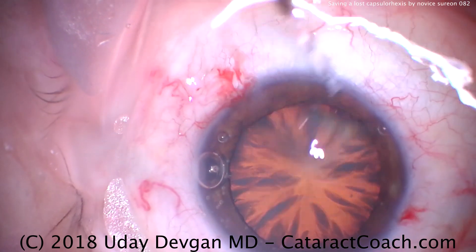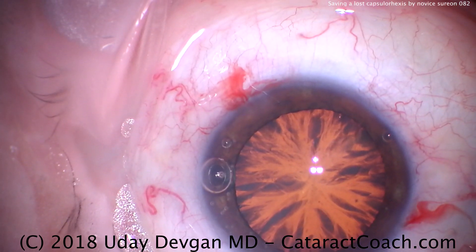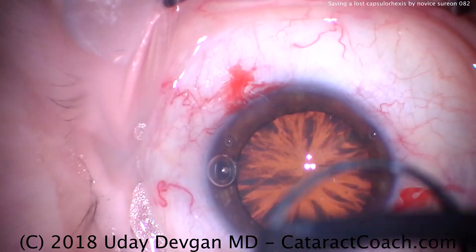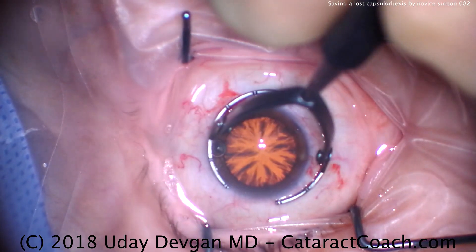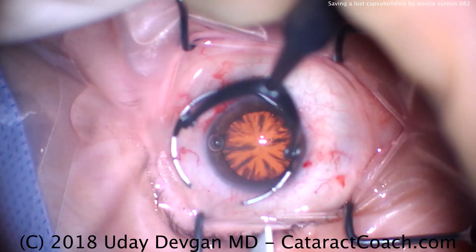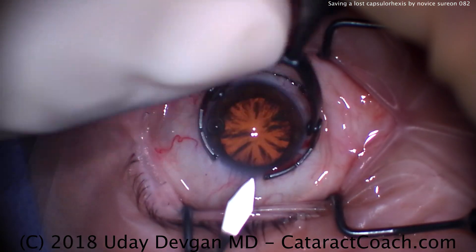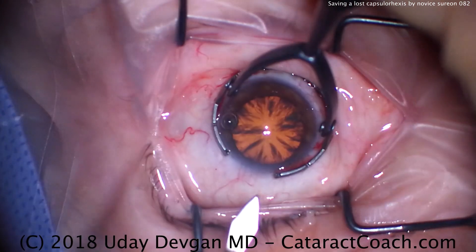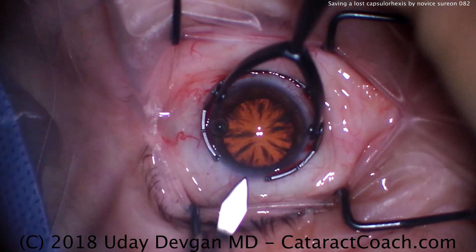Now it's going to be time to make the main incision. This is a tough case for the resident to choose because it's a tough view. Zooming out here, fixation ring going on the eye, and then the keratome is going to be used to make this incision. In this case, we have the resident operating superiorly because that's his choice.